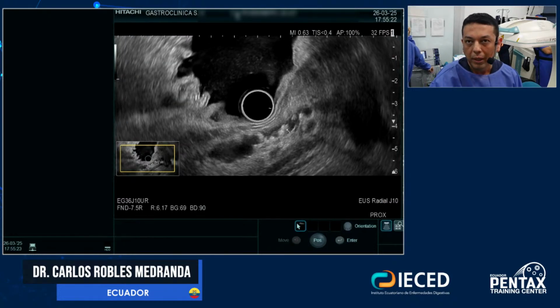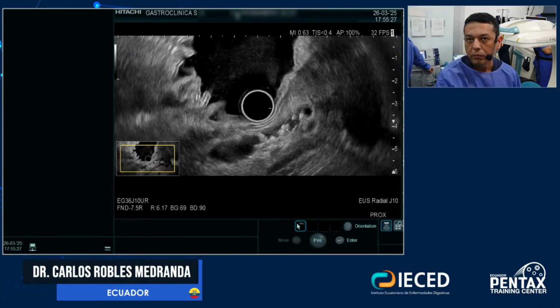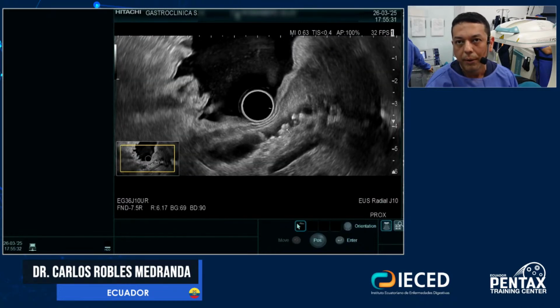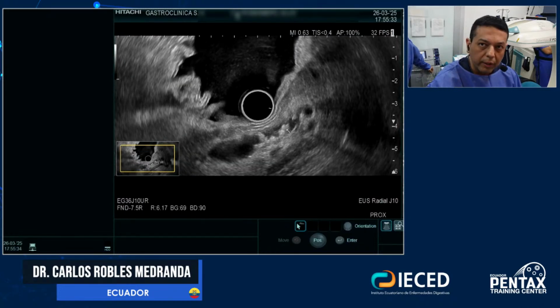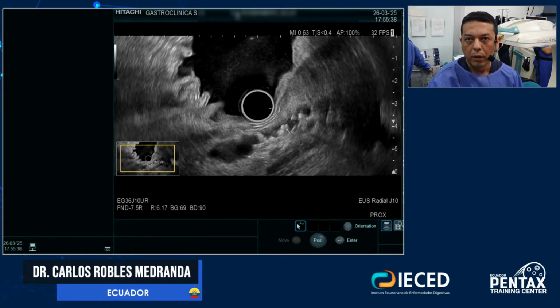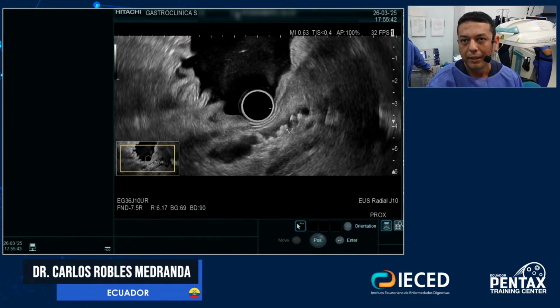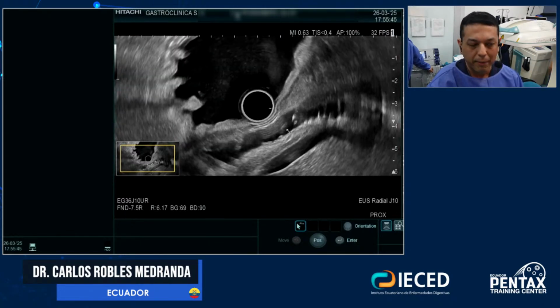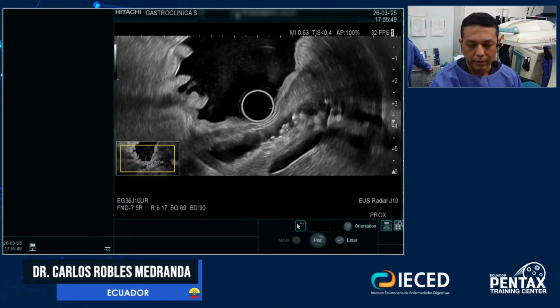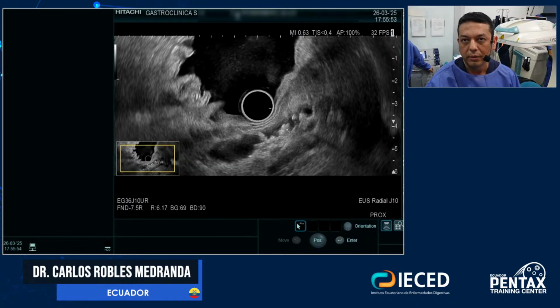This is my suspicion, thinking a little bit more, not just saying, okay, this is a chronic pancreatitis, it is finished, we need to treat. It's not about that. It's about thinking and evaluating very well by US, right? So I remember a lot one of my mentors, Bertrand Napoleon, that I always have in my mind, always explaining to me this kind of small alterations that we can see during US, right?